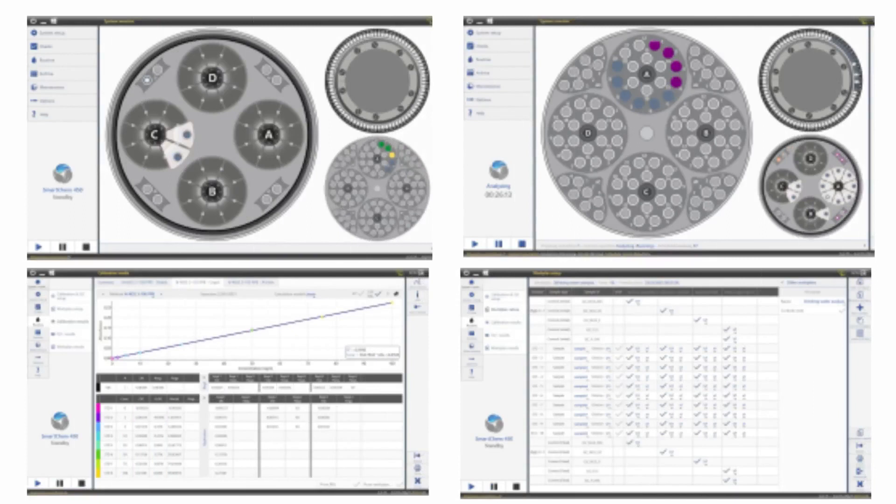SmartChem software simplifies routine work and allows complete control and operation of onboard reagent stock, samples, controls and calibrators, plus the status of the cuvettes in the reaction chamber. This software is compatible with LIMS. Once routine analysis is finished, all results are presented in a report that can be exported to LIMS.